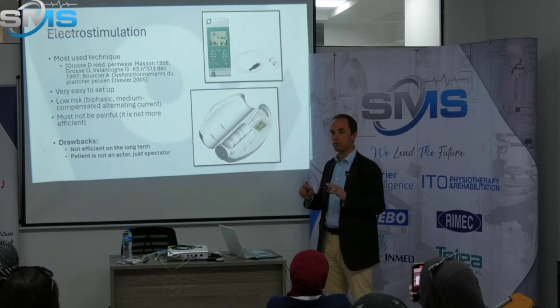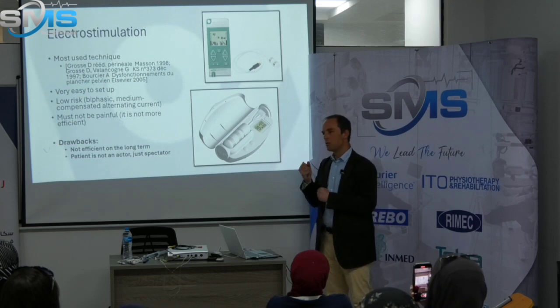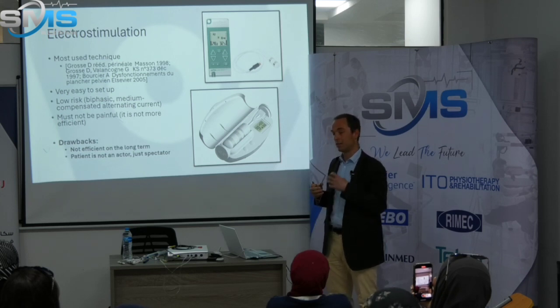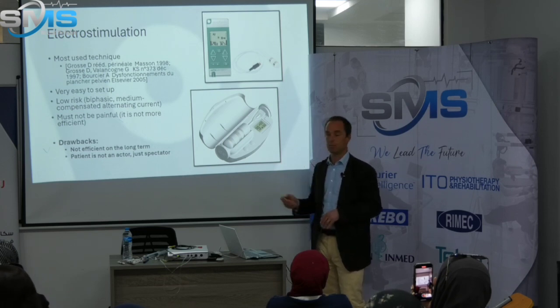More importantly, if it's painful, it's not more efficient. If you see that your patient wants to do the best, to have the best rehabilitation and goes up with the intensity, she will feel pain. You must lower it as fast as possible because it will not be efficient.